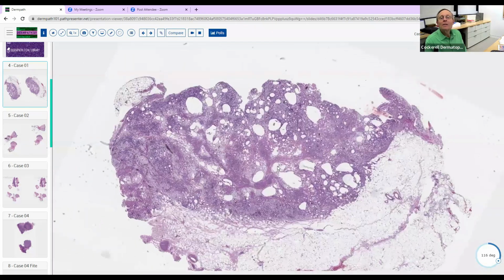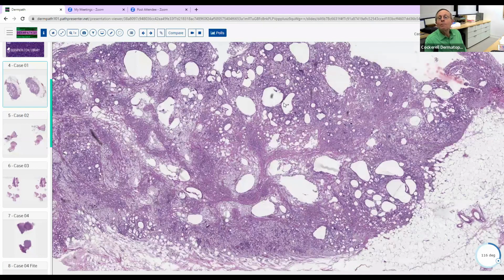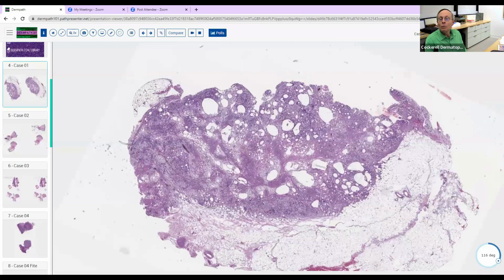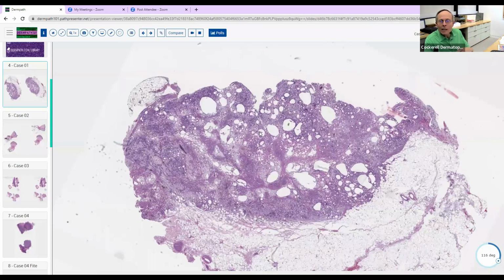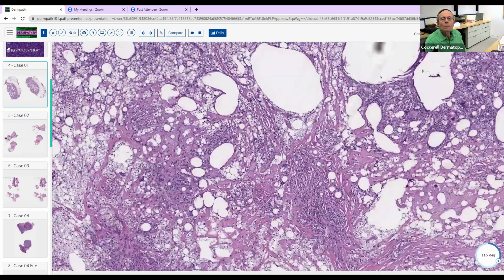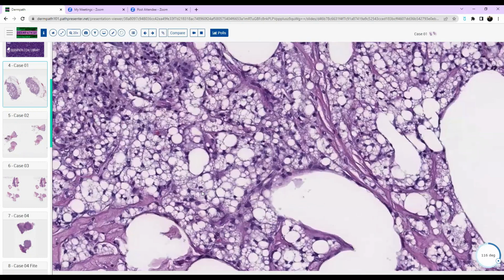Okay. Let's go back and look at a little higher magnification. If you thought it was a neoplasm and benign, obviously you thought benign because it was kind of well circumscribed and symmetrical and all that sort of thing. What kind of differentiation do you think we're looking at here? I think it's mostly adipose cells with little vacuoles, like multi-vacuolated adipose cells.